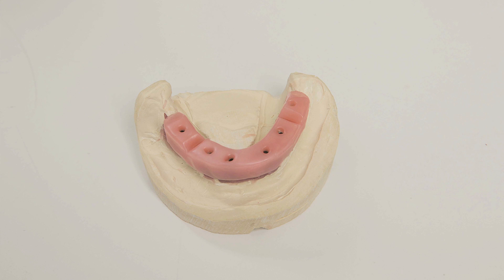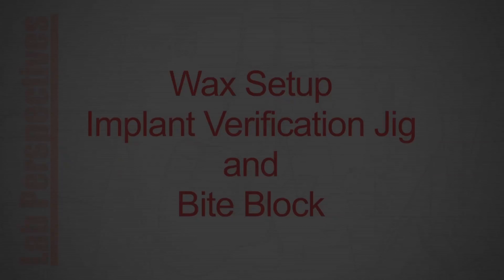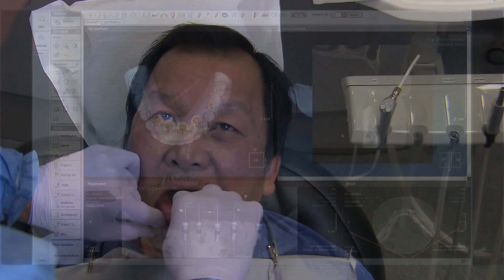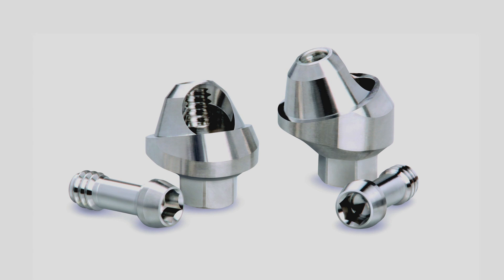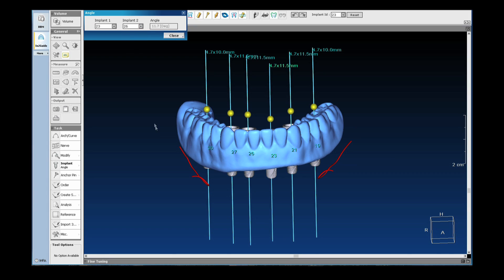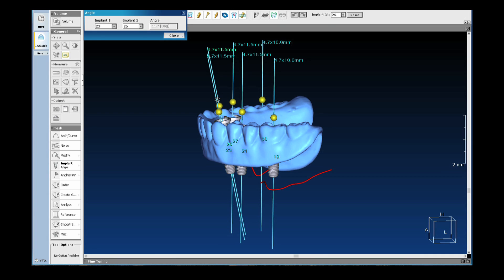The bite block is then ready to be sent to the doctor. After the doctor takes the jaw relation records, bite registration, and impressions of the opposing dentition and current denture, the definitive restoration option is determined by the lab. The bite block is secured to the working model and mounted on the articulator, and the case is evaluated for possible implant trajectory issues. Multi-unit abutments may be required to correct implant angulation, accommodate screw access holes that are angled too far to the facial, or connect the prosthesis to implants that are positioned more than 2 mm subgingival.